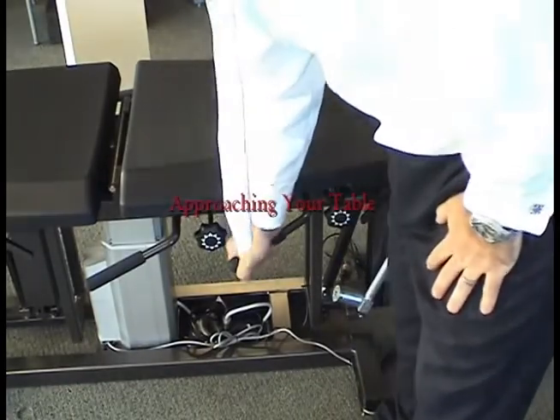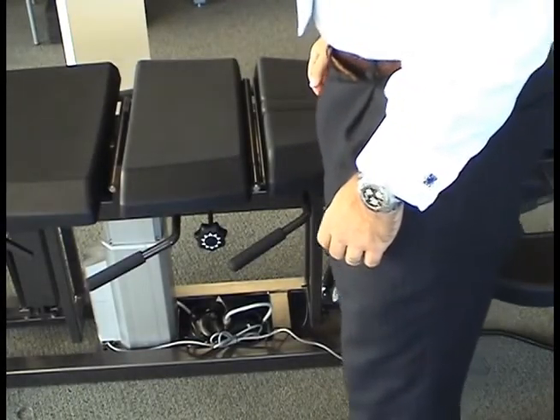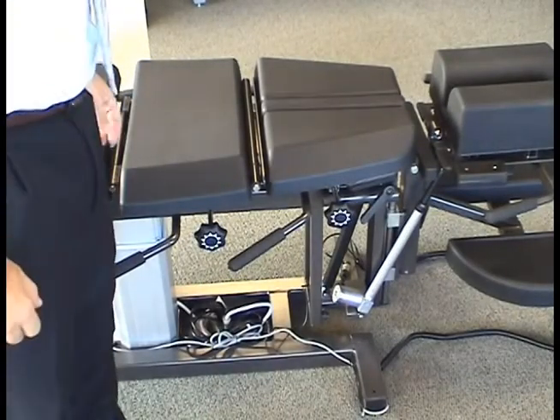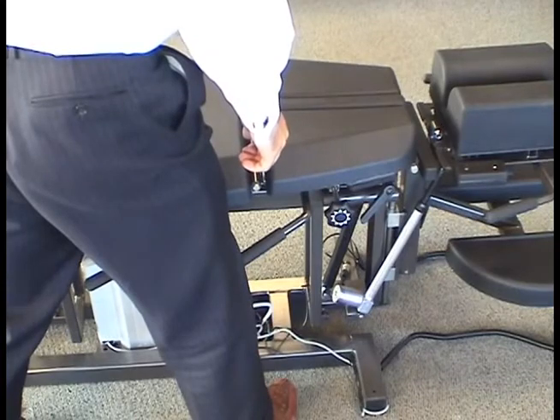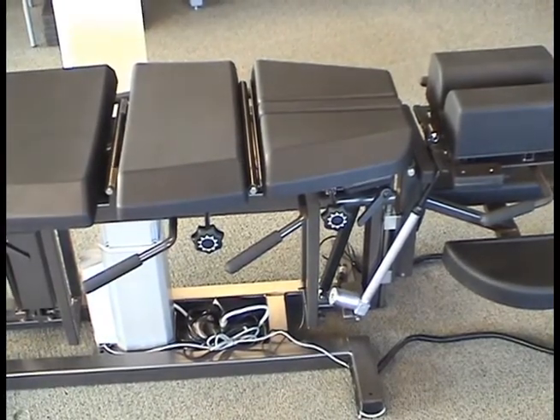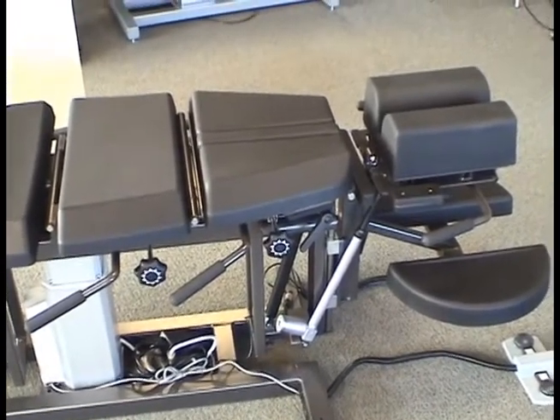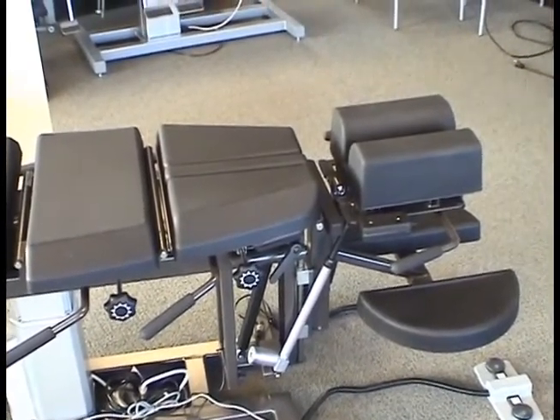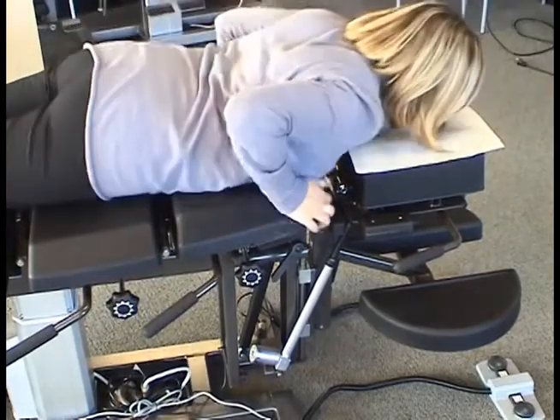The thoracic and lumbar cocking handles are ergonomically positioned for use. Caution should be used when approaching the table where these handles protrude in order to protect your legs from bumping into these levers. In some instances, it's best to straddle the thoracic and lumbar cocking handles with a leg on either side. It is recommended that the practitioner informs the patient of the above stated safety concerns so as to familiarize the patient with the table, attempting to prevent any mishaps. When in the prone position, make sure the patient is trained to place both hands on the semicircular pads.